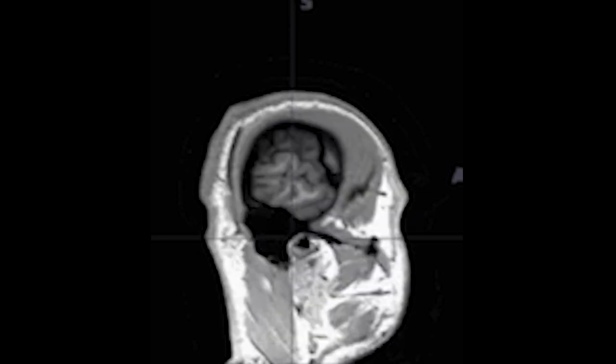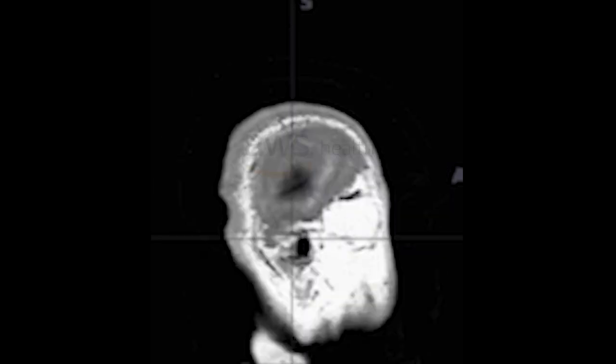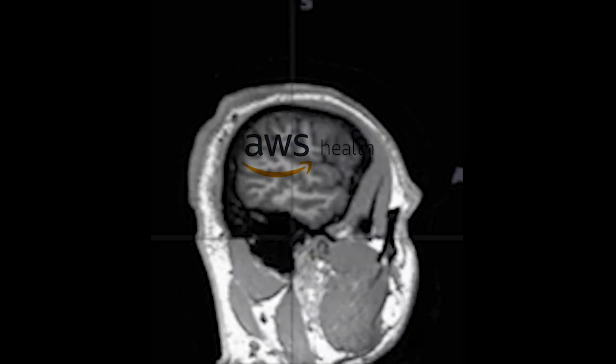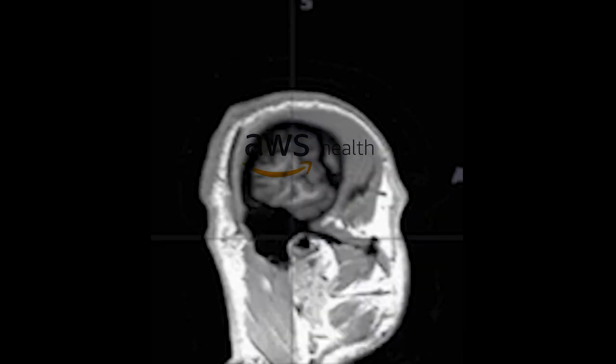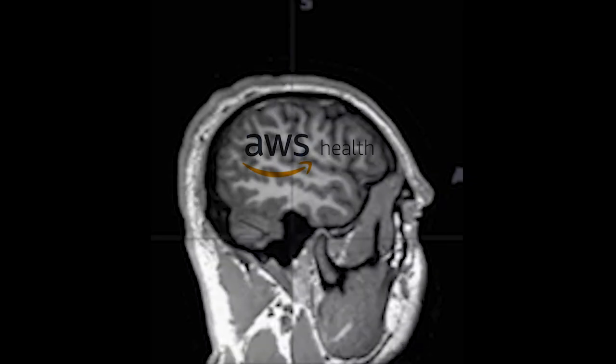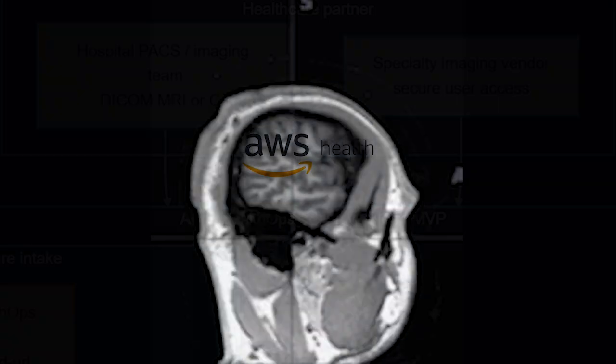Hospitals and specialty imaging vendors need to exchange DICOM imaging studies securely. Flat file shares and manual handoffs make it difficult to limit access, reject bad files, preserve the original clinical study, and prove what happened to the data afterward.